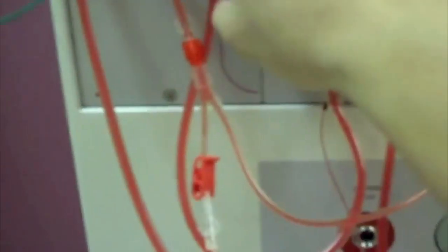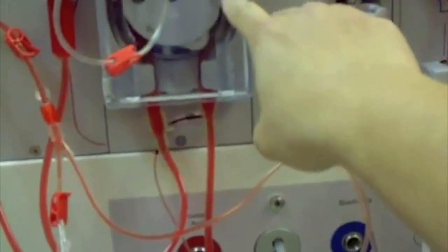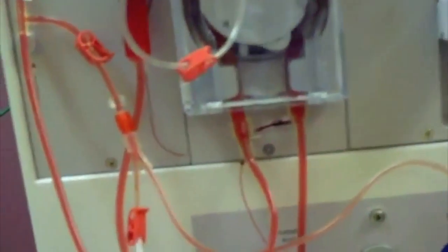After the arterial chamber, the blood goes to the pump. They call it the blood pump. The blood pump acts like your heart. It pumps blood to the kidney system. For this matter, the blood pump pumps blood to the dialyzer.